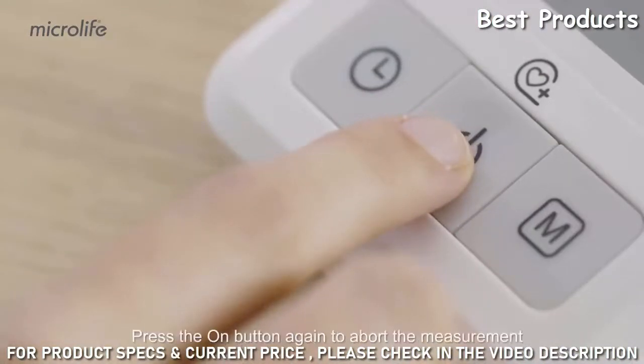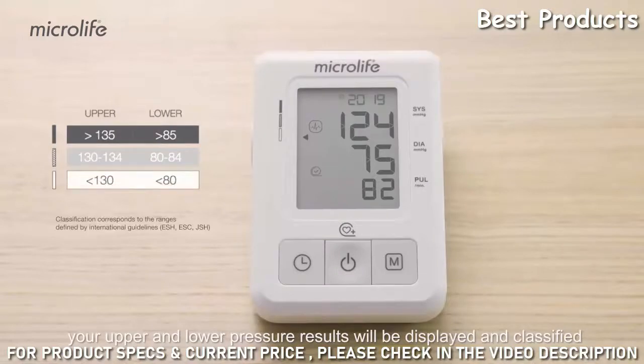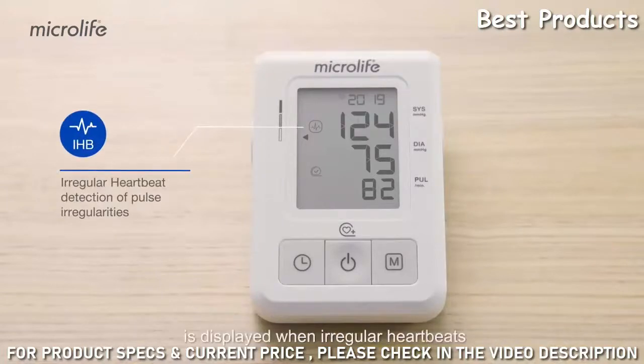Press the On button again to abort the measurement. When the measurement is completed, your upper and lower pressure results will be displayed and classified using the clinical guidelines on the blood pressure level indicator.